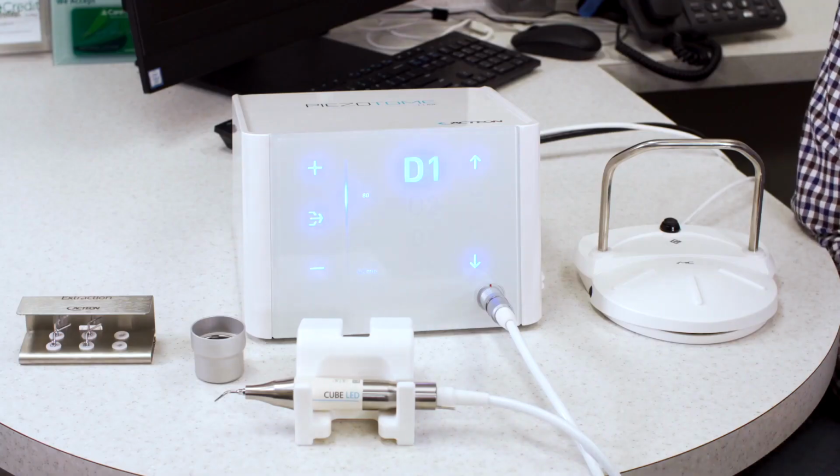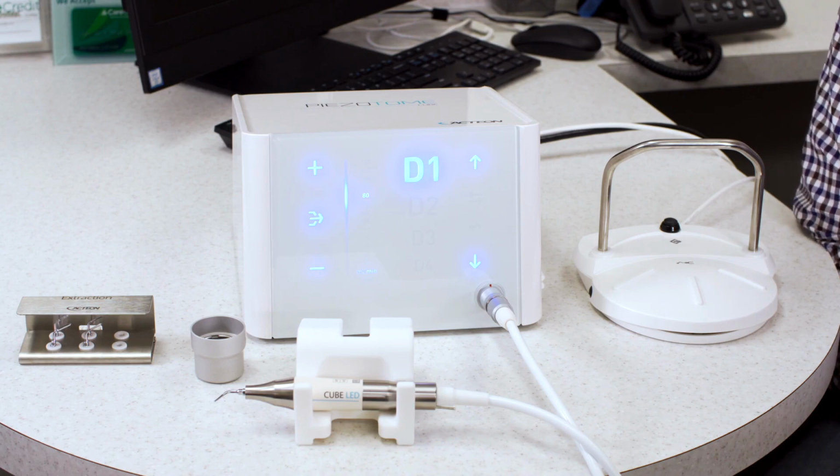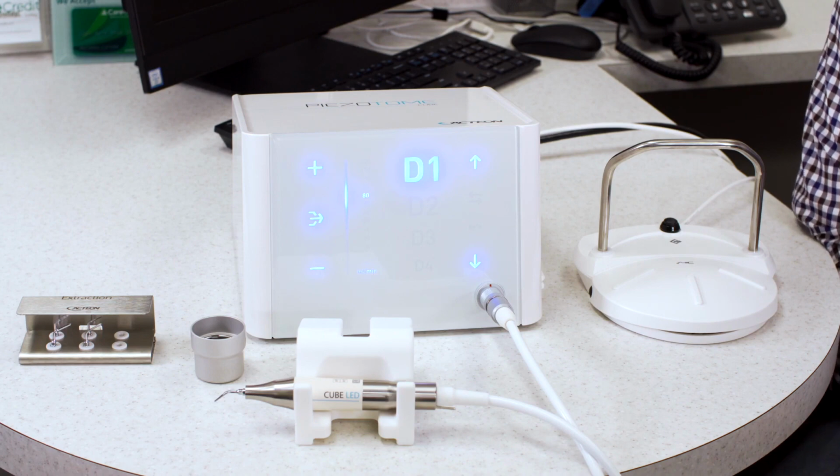Okay, first we're going to look at what the Cube is. The Cube is an ultrasonic bone surgery device. It uses high-frequency ultrasonic vibrations that cut dense bone while not cutting soft tissue. It provides a fast and most minimally invasive method for extractions and bone surgery.